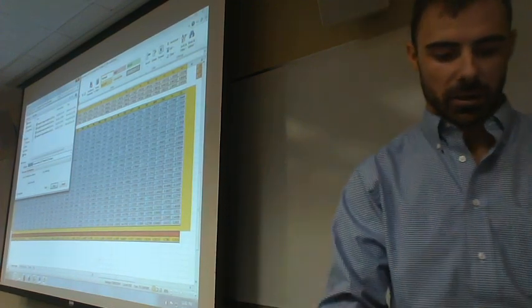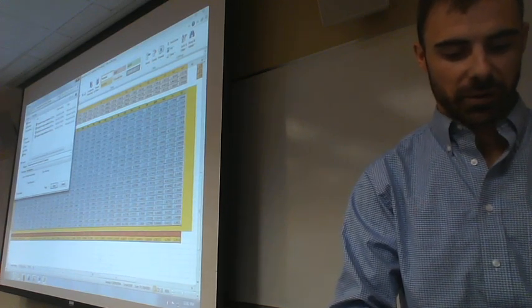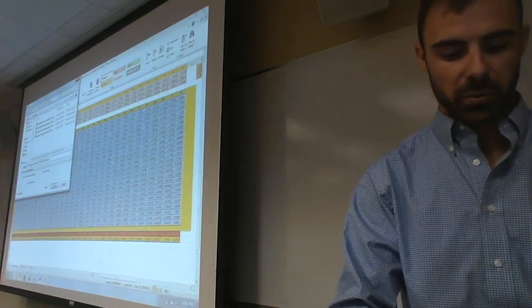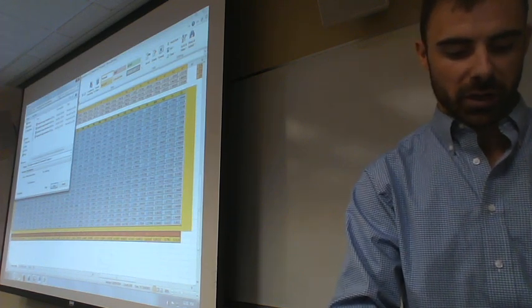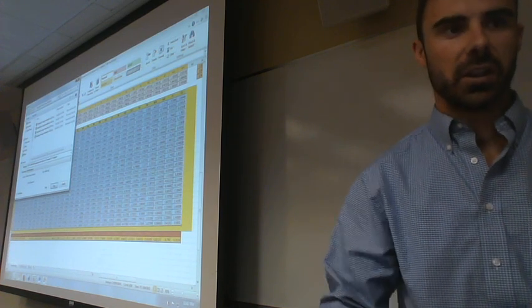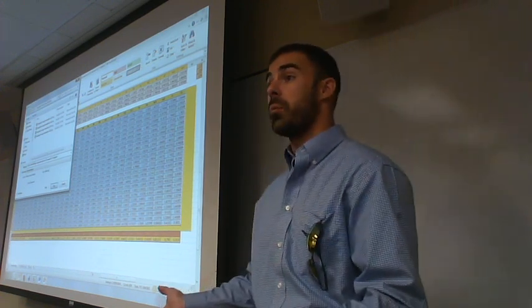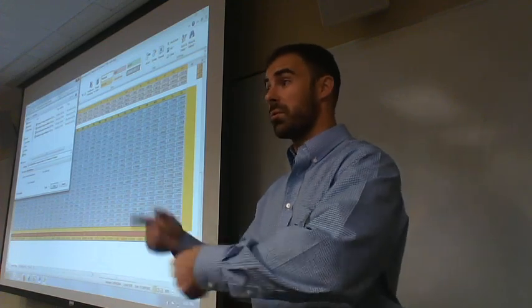You're going to say, you know, the sample size N25, what your bin was, or your condition. So in this case, it was bin 188. Put your latency in there, 400 to 600 milliseconds. Again, we're labeling the file so we can go back and get it, because you want to keep your template blank so you can continually reuse it for other people.